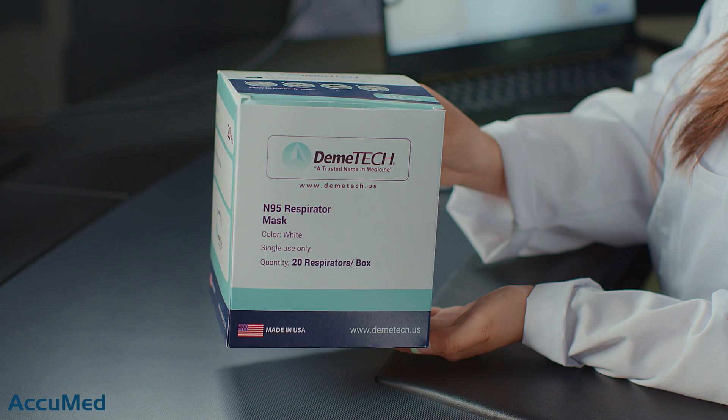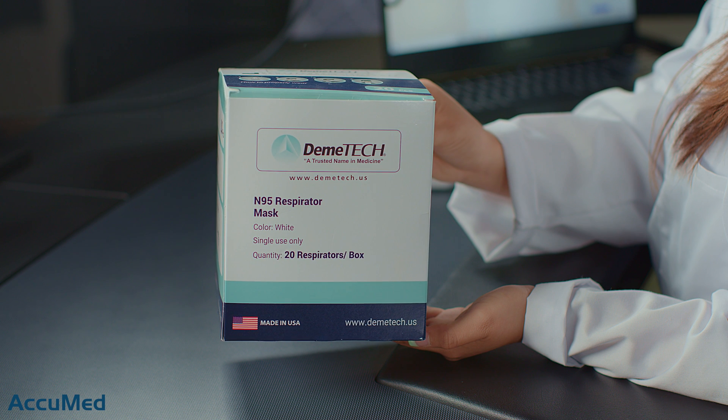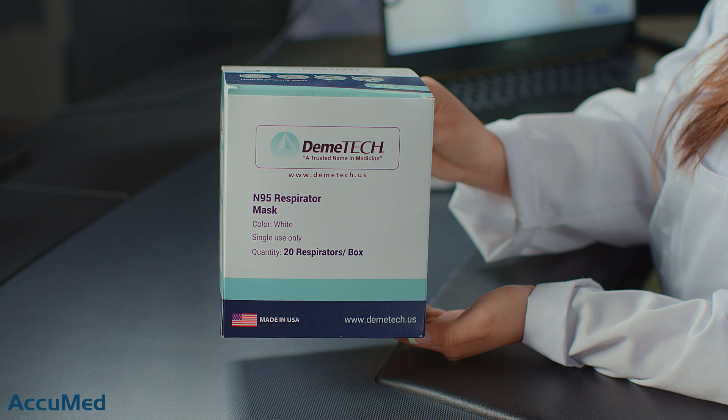Hello everyone and welcome back to the AcuMed channel. Today we're going to be reviewing the Demitech N95 respirator. These respirators are made in the US. Let's go ahead and look at the Amazon listing before we try them on.